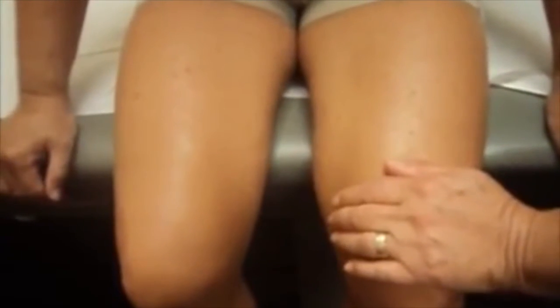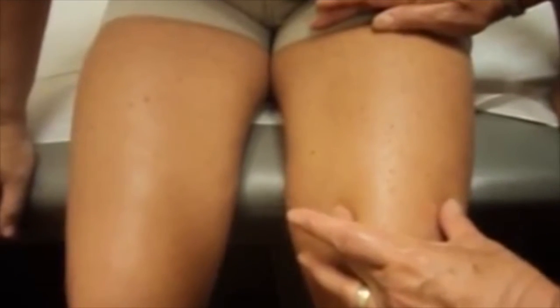First, let's talk about the thigh, because that is the easiest for someone giving a self-injection. To find the proper injection site, it's very easy to locate. You put one hand over the knee and one hand around the hip, and you have this middle area to give the injection. In this area is a large muscle, and it can be given anywhere in this area, and what you want to do is just aim off from the side a little bit and go off center.